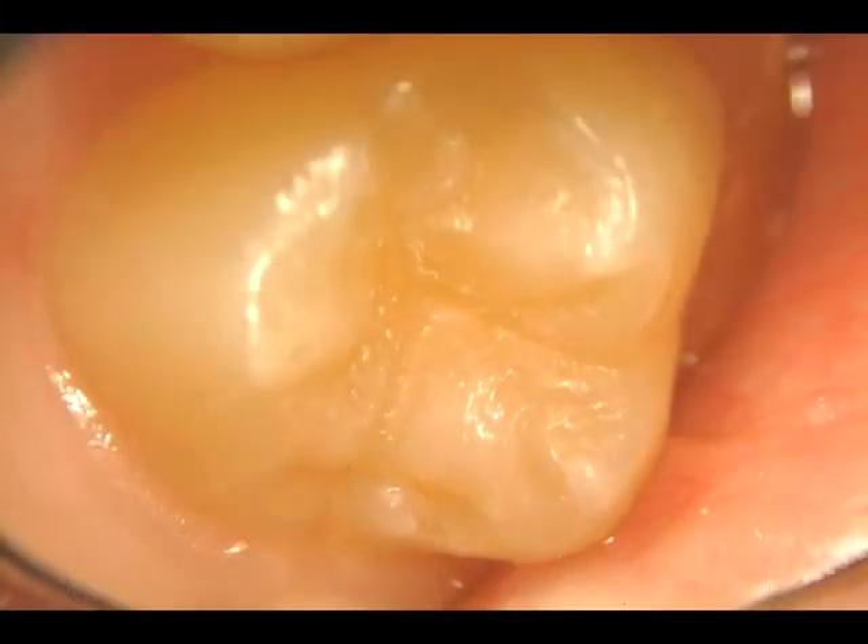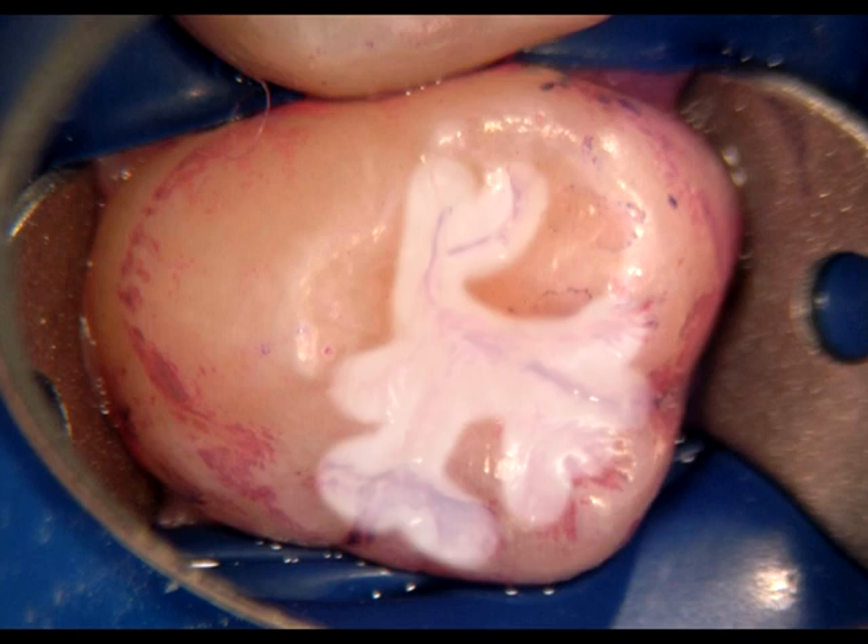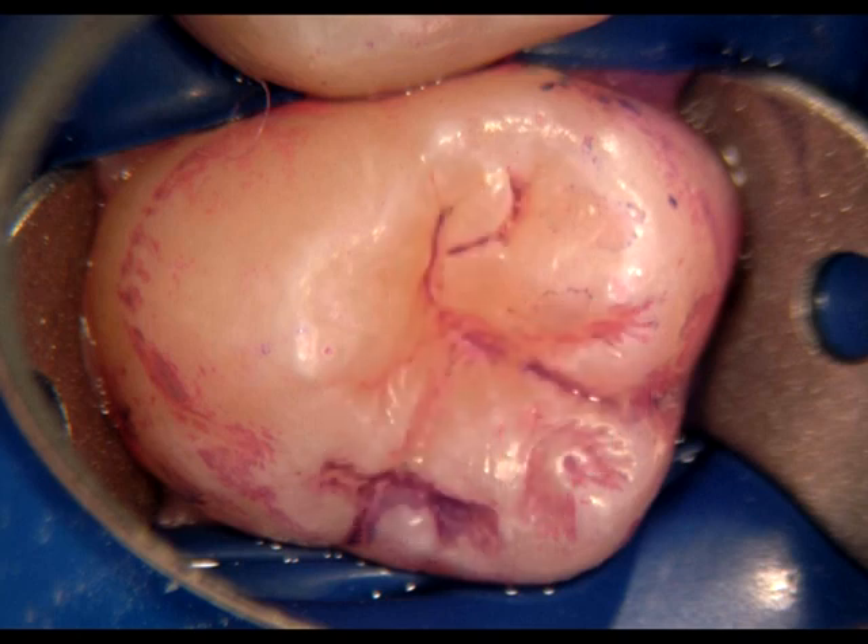This photograph shows a typical occlusal surface of an upper second molar in an adolescent. This next slide shows the same tooth after disclosing solution. As you can imagine, trying to bond a sealant over such a contaminated surface can be compared to painting over rust. Let's take a look at how traditional painted-on sealants are actually holding up under the microscope in a short movie titled The Sealant Failure Festival.